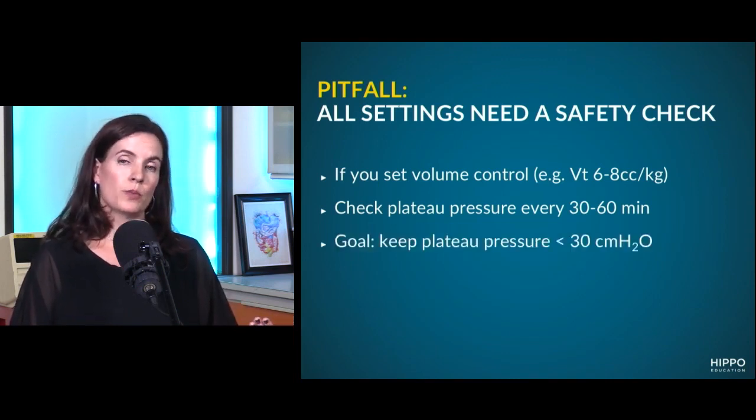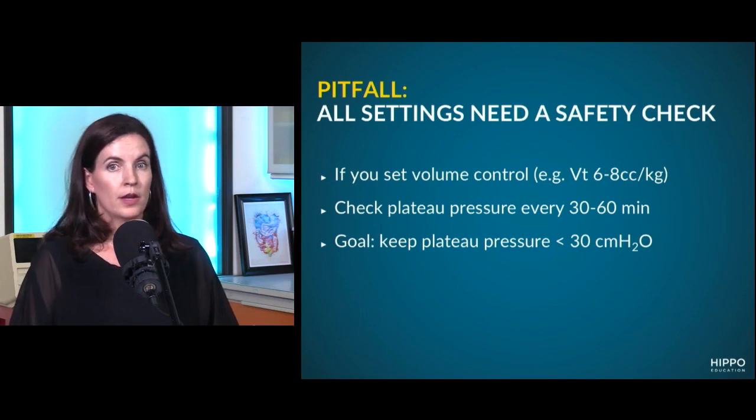And you want to keep your plateau pressures less than 30 centimeters of water. And the plateau pressure is the pressure at full inflation of the lungs. Is that right? Or at full inflation on a breath hold. Okay. So your initial pressure will peak higher in the first less than a second and then hold at a plateau. Same as it takes more pressure to blow up a balloon than it does to keep it open once it's open. Your lungs are the same concept. So your plateau pressure less than 30 means the pressure that your alveoli are actually seeing is safe for them. When we take these pressures too high, you run the risk of popping one and getting yourself a pneumothorax.